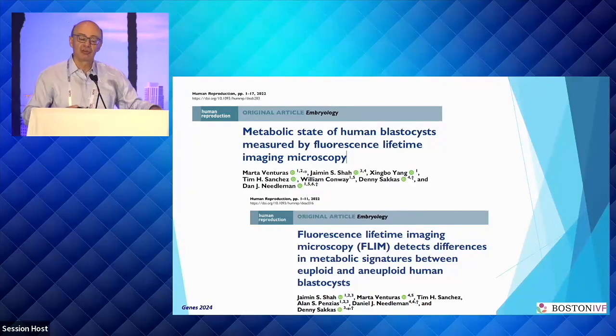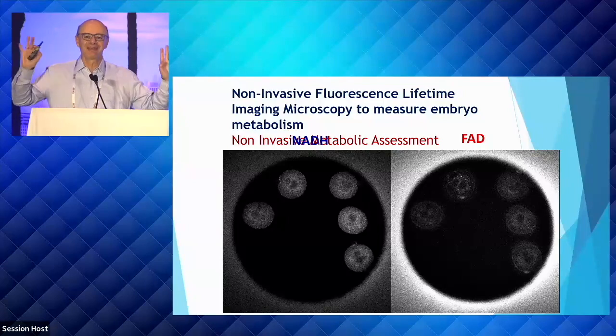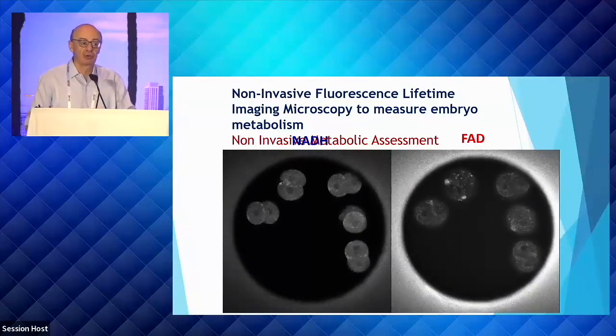And this technology is really cool because what it does, it allows us to non-invasively look at the metabolism of embryos. Obviously a lot of other cells. And on the left-hand side is NADH, and on the right-hand side is FAD. If you vaguely remember any of your biochemistry, these are very important parameters in mitochondrial metabolism.